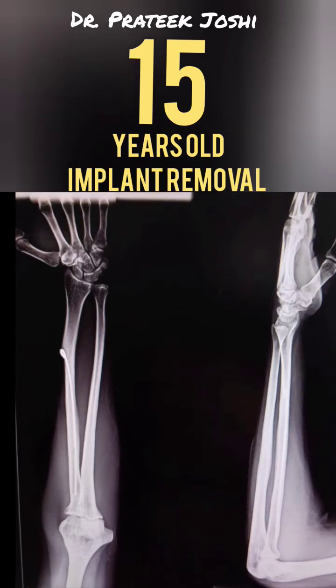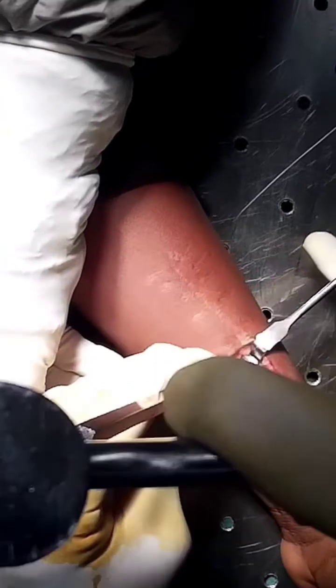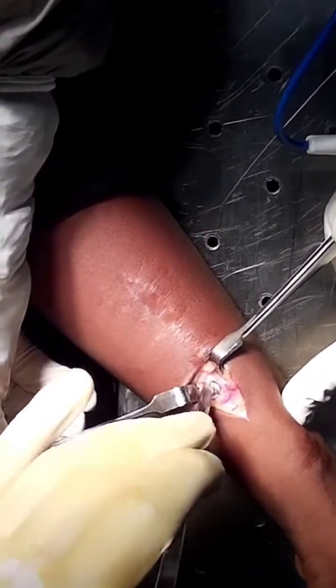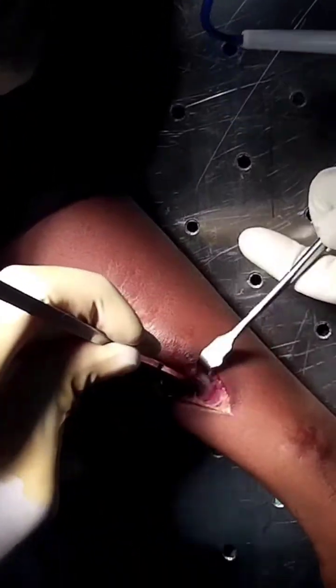You can appreciate that the growth of the distal radius physis has led to proximal migration of the tip of the rush pin, so much so that it's now lying at the level of the diaphysis. All the excess bone around the tip of the implant should be excised completely with the help of an osteotome. But at the same time, we should also be careful not to fracture the radius.